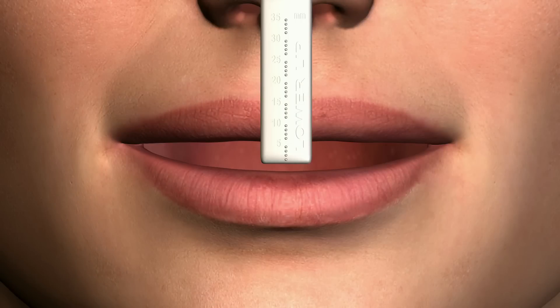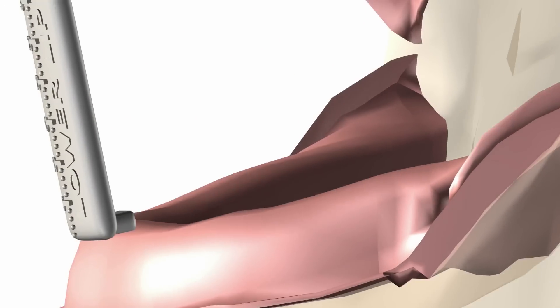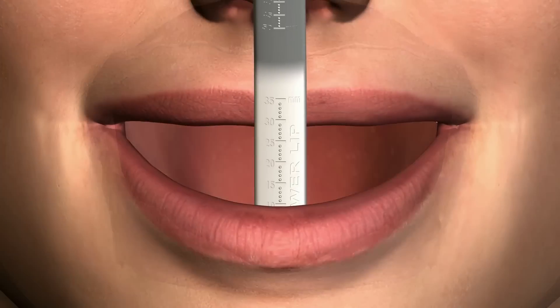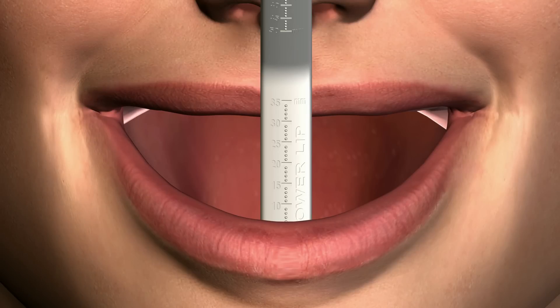For the mandibular arch, slide the lower half of the lip ruler under the lower lip until the horizontal stop rests on the pre-mandibular ridge crest. Have the patient relax the lower lip, read the number on the front of the ruler at the lip height, and record this measurement as the relaxed lower lip position. Then have the patient display a full smile and record this measurement as the smiling lip position.